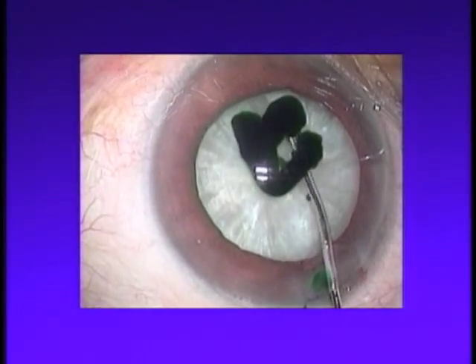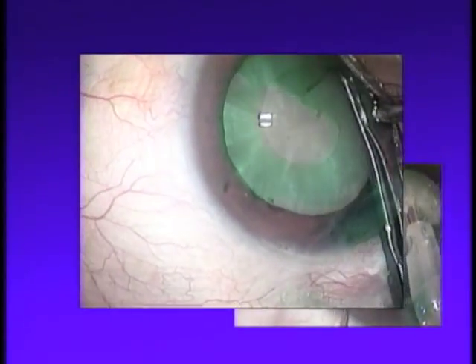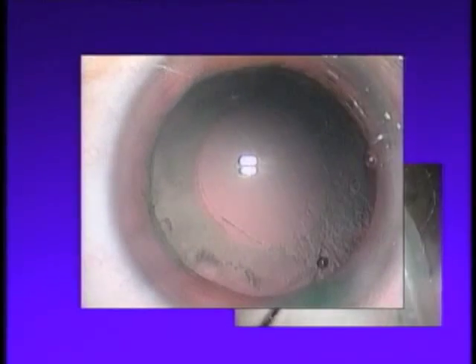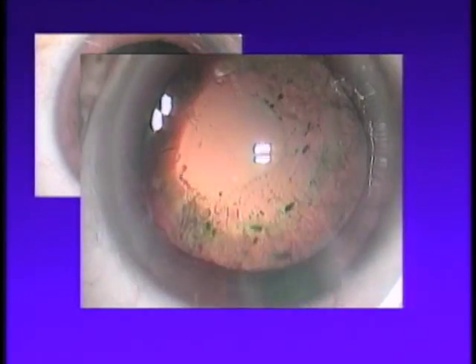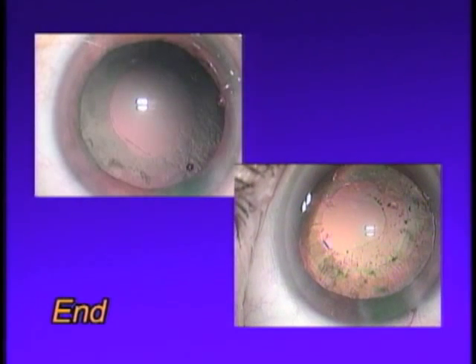We believe the two anatomical images presented here, obtained by staining a white cataract with Visco-ICG, provide important findings. The first deals with a split anterior capsule structure showing tearing of the capsule into two flaps. The other shows that Weaker's ligament can prevent Visco-ICG from penetrating into the Berger space. Thank you for your attention.